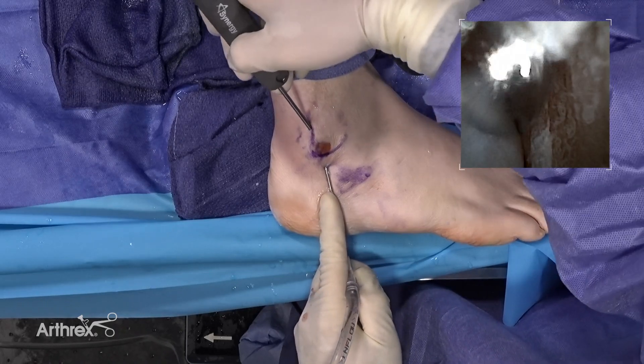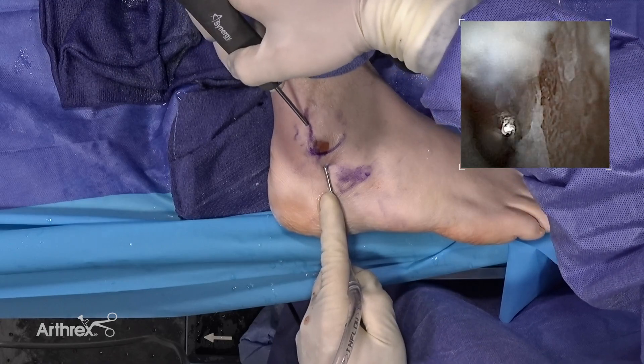Again, this is a demonstration, but in cases where we encounter convexity at the peroneal tendon groove, this technique will allow us to perform a groove deepening procedure effectively. See how we can do the debridement very nicely.